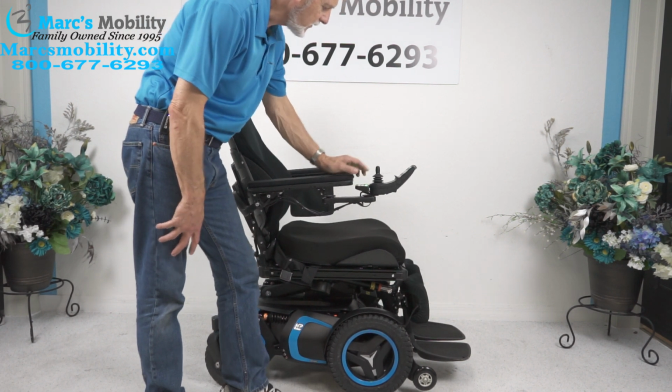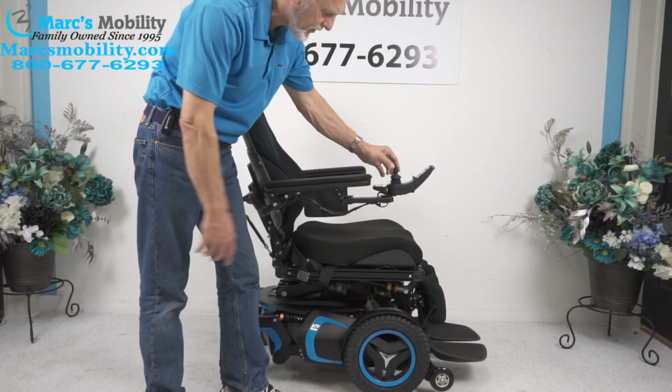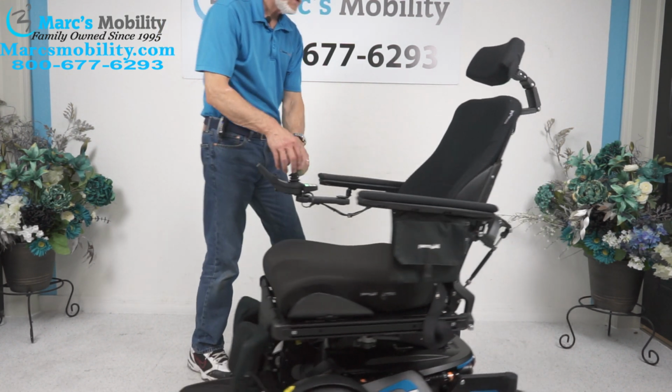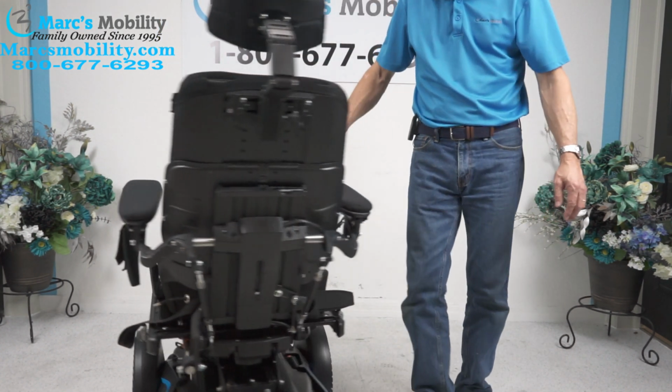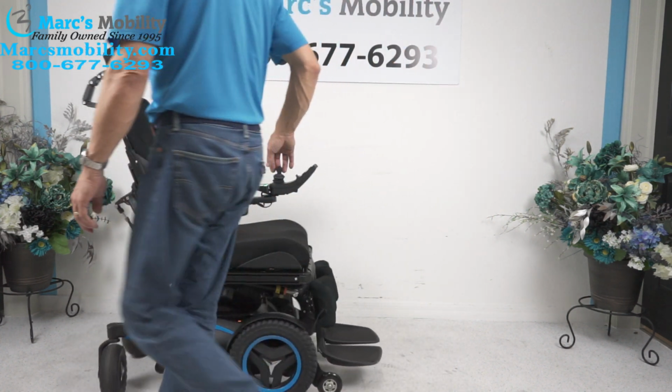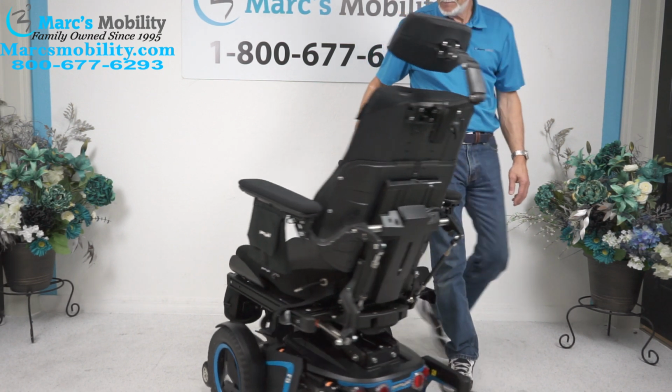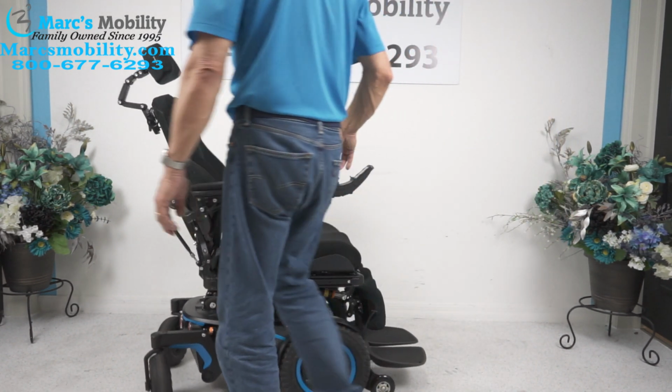All right, so on this chair here, it's a front wheel drive. So if you have it in the house, you can see, let me bring it over here so we can see. This is how it would turn inside your house, okay? Let me bring it closer to the wall. There we go. This is your turning radius inside your house. That's what it would look like.